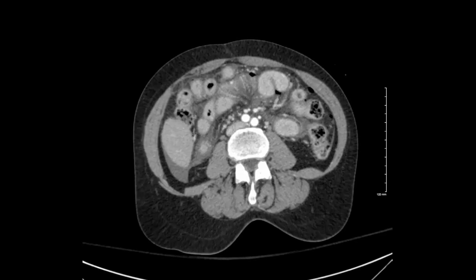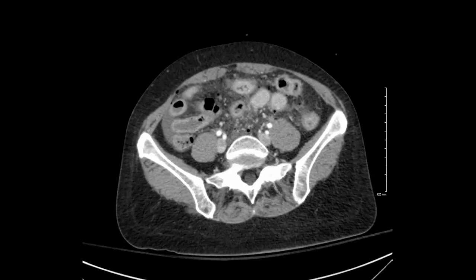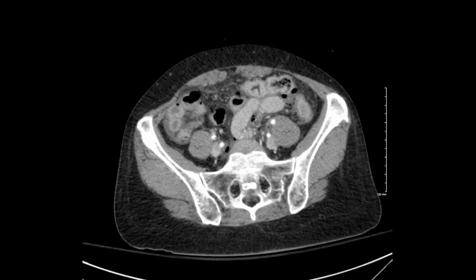Her CAT scan demonstrated free air, free fluid, perforated sigmoid diverticulitis, and a fair amount of fluid material within the pelvis.